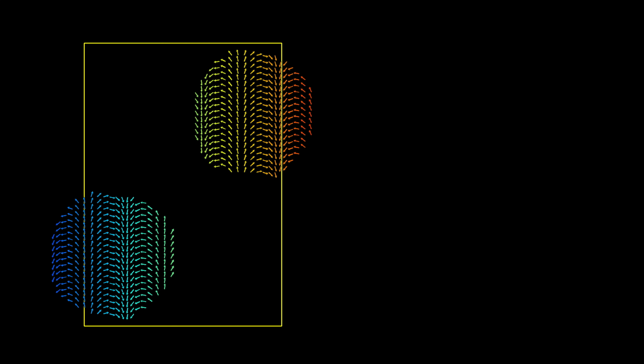But what about in the readout direction? Well, because the readout is a real-time digitization, the spectrometer can filter out unwanted frequencies either using analog or electronic filters, or more commonly by oversampling the readout. We'll leave those details for another day, but the bottom line is it matters what direction you phase encode. Always try to ensure no spins are outside of the phase encode field of view.